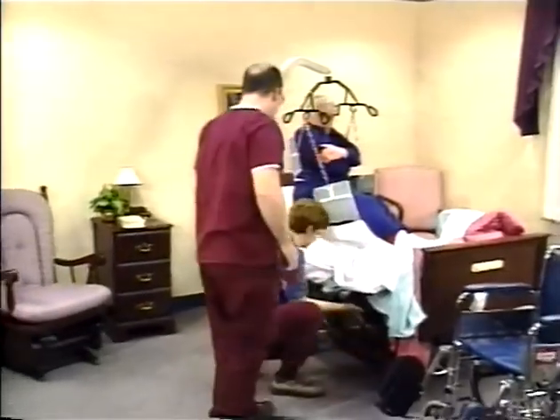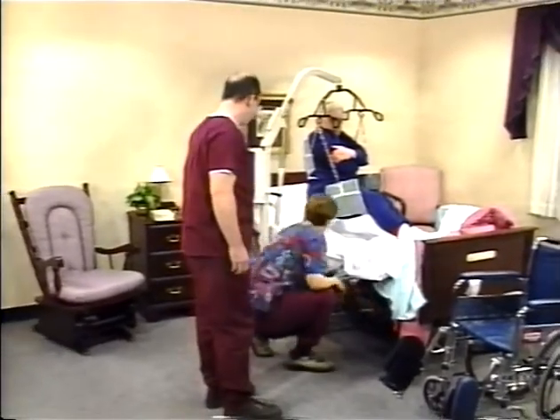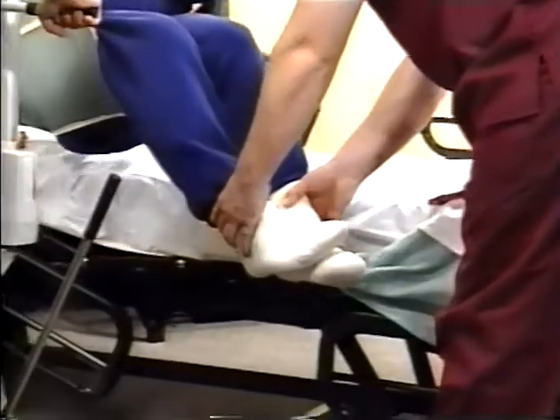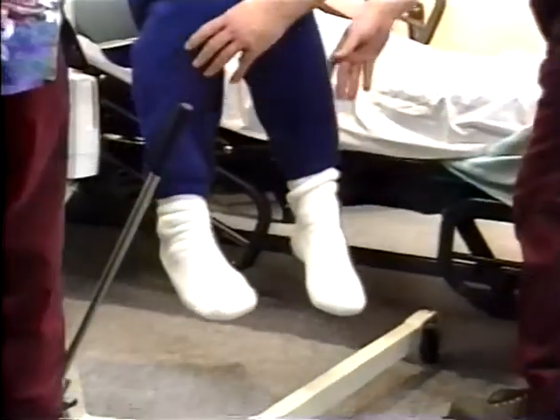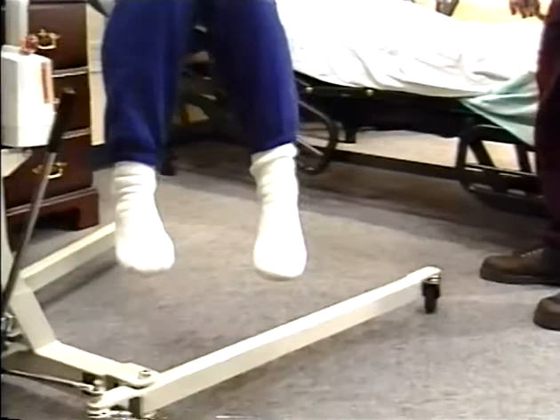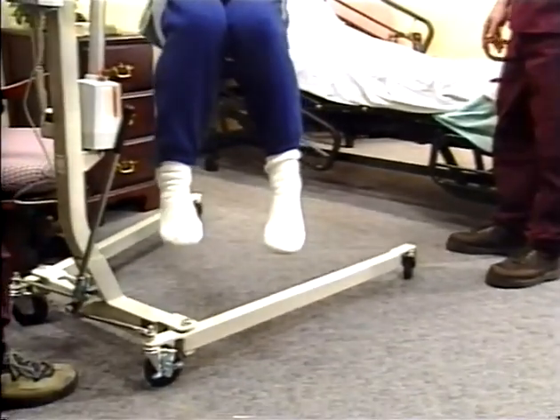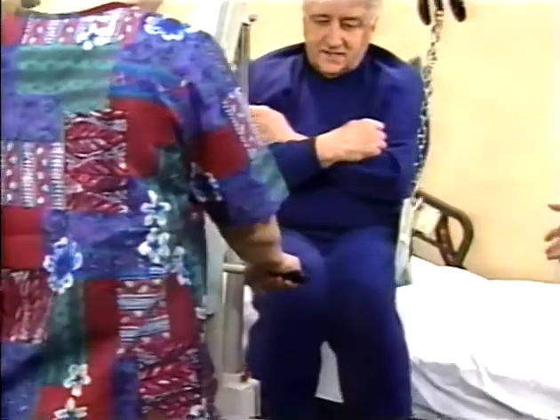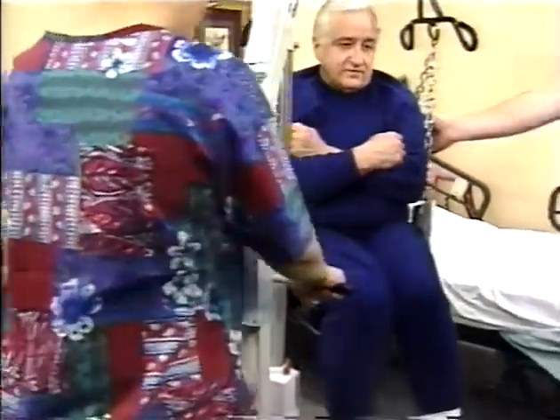Lower the near side rail. Rotate his legs so they overhang the edge of the bed and he's facing you and the lifter. Lower the bed if you need more clearance. Make sure there are no obstructions over the bed or in your path to the wheelchair. Grasp the steering handles and move the lifter away from the bed.